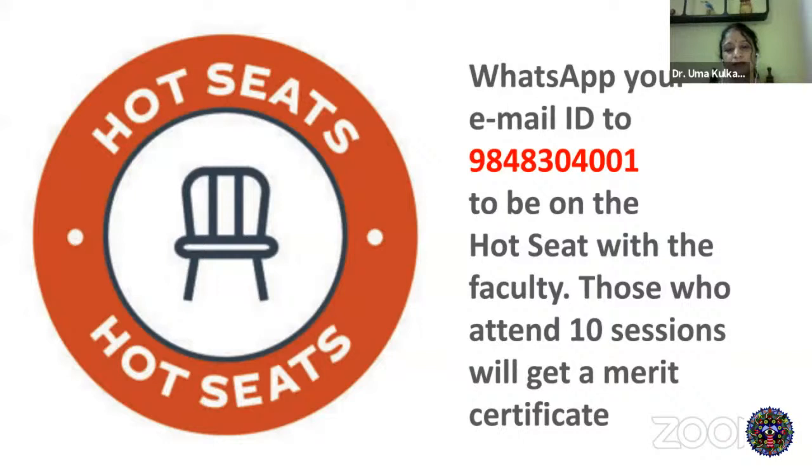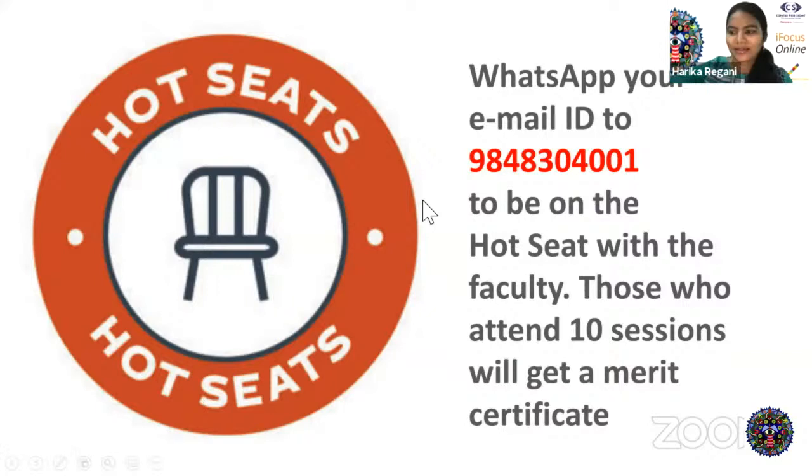Okay. One question is on the gonioscope, ma'am. What is the shape of the peripheral lens in the three mirror gonioscope? The peripheral lens is the oblong one, the rectangle one. The equator one is the oval, the large oval size. Okay. I think these are the questions, ma'am.